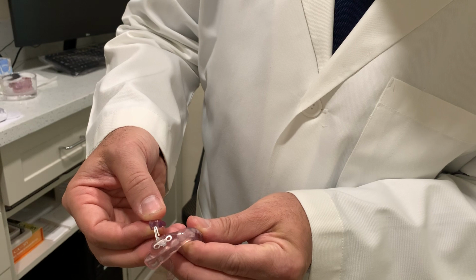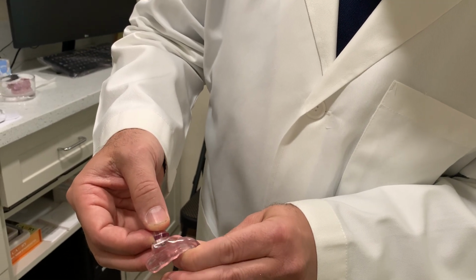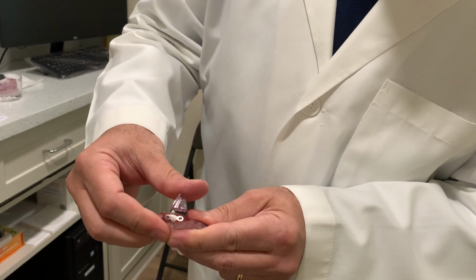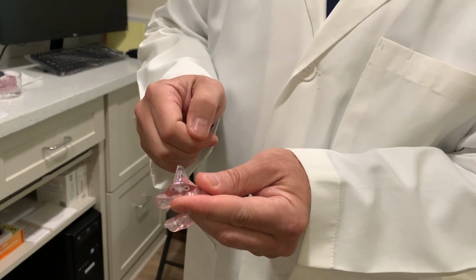There's a little slot there. The groove is to the back and to the inside. You have to line it up. It perfectly fits in there. And then you're gonna snap it in place. If you do it this way, you may hurt your thumb. I like pinching it and snapping it in.